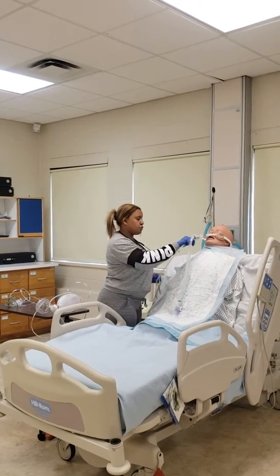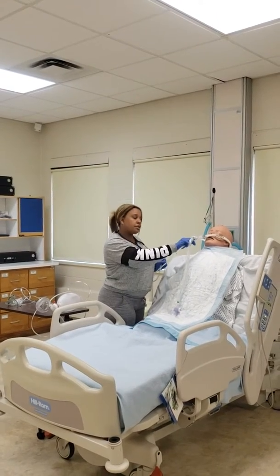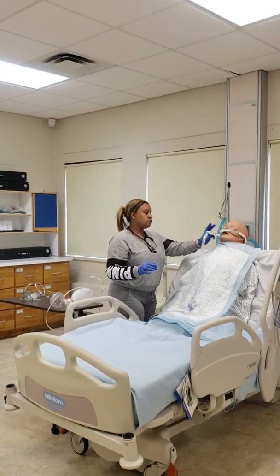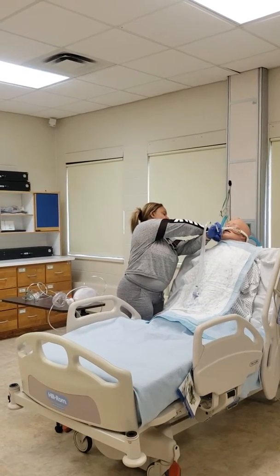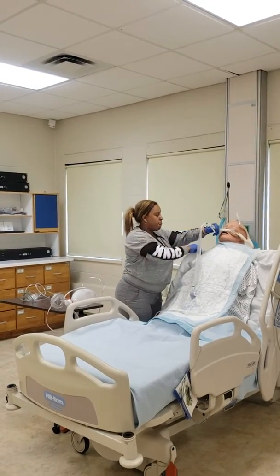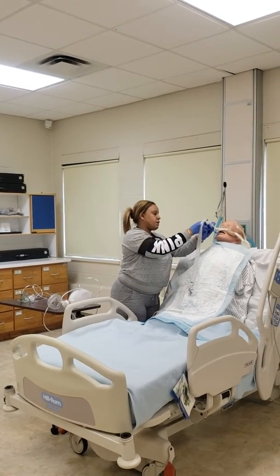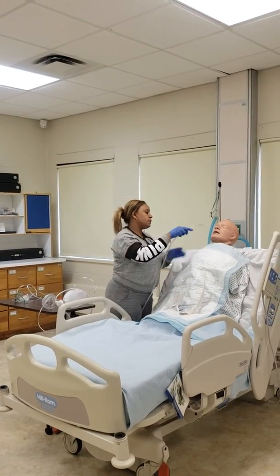I'm going to suction the oropharynx and hypopharynx to remove secretions above the cuff. Okay, good job. I'm now going to hold the endotracheal tube, and I'm going to remove the commercial endotracheal tube holder. All right, Mr. Jones, when I tell you to take a nice deep breath, okay, take a nice deep breath. All right, good job. While he's taking a nice deep breath, keep coughing, cough for me.